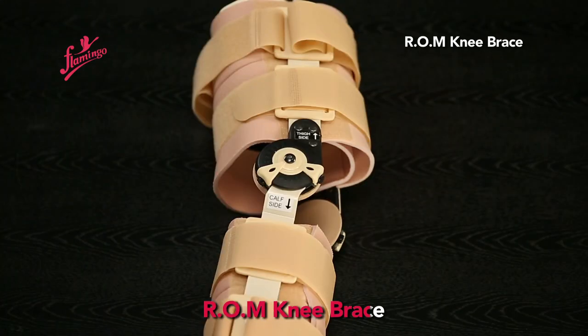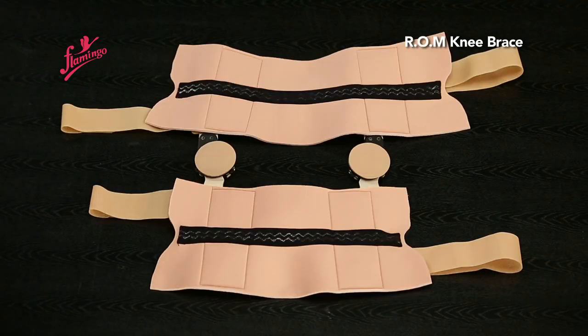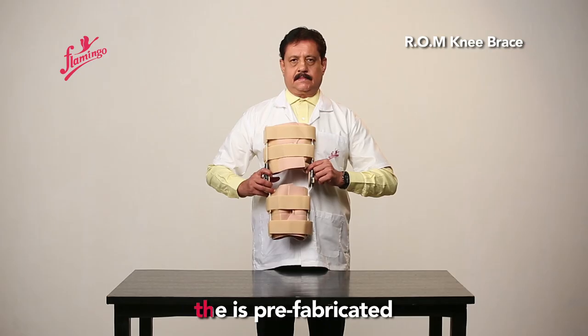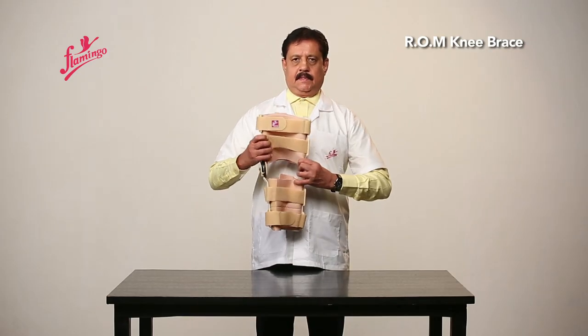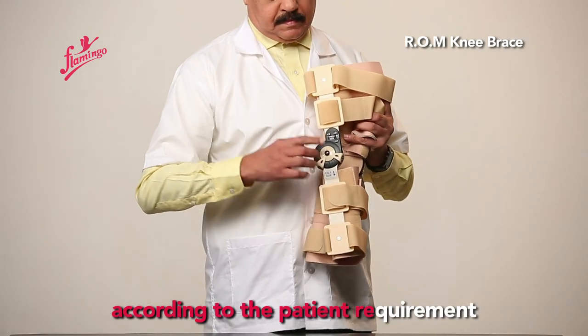R-O-M Knee Brace. In universal size, the brace is prefabricated and custom adjusted range of motion knee brace according to the patient's requirement.